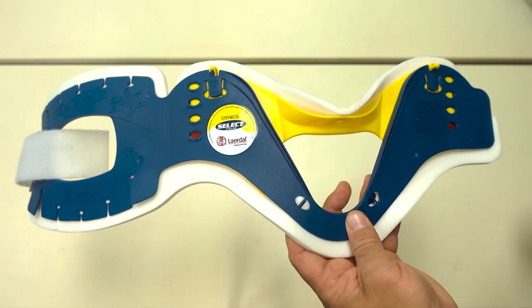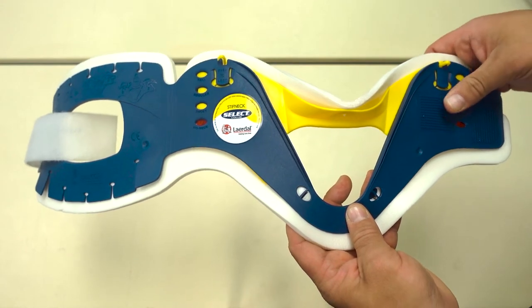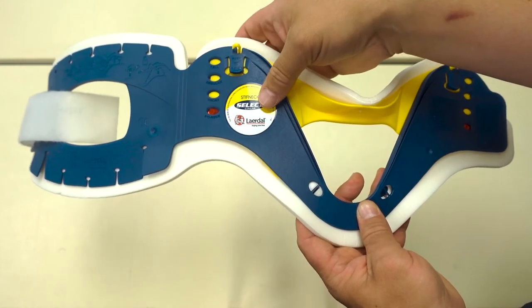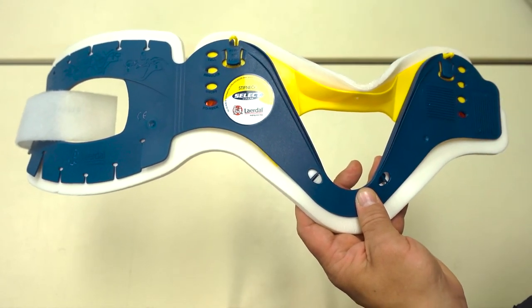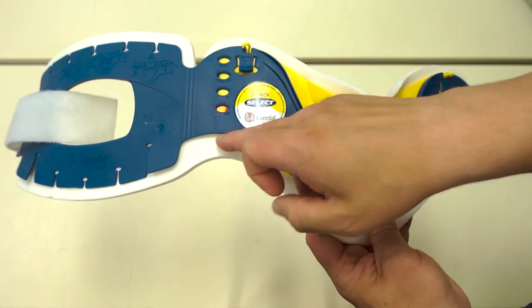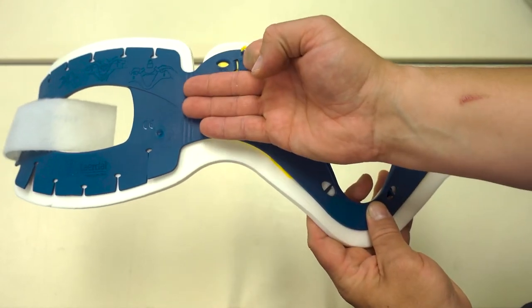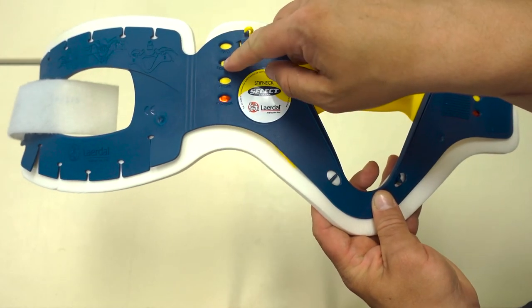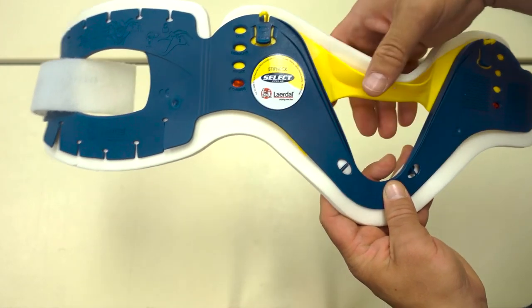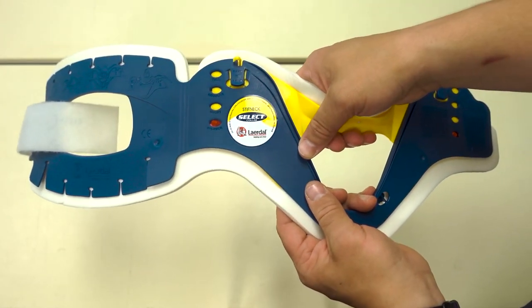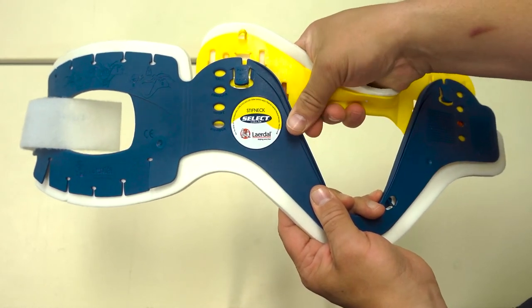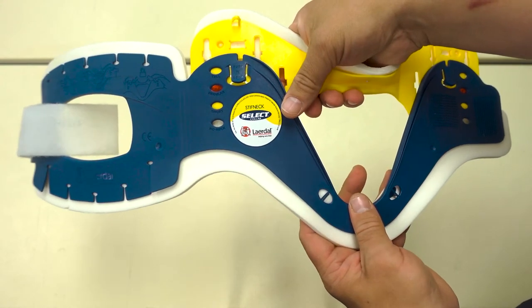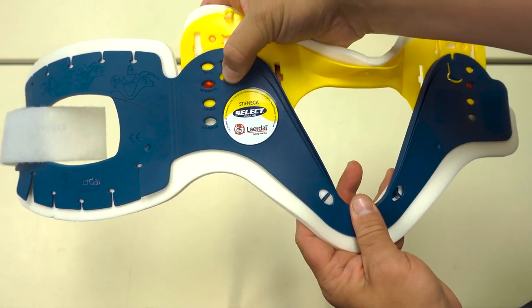To adjust the Laerdal Stiff Neck, if necessary, begin by releasing the locks by pressing on the tabs from behind. Next, using the measure you took from the patient with your fingers, measure from the bottom of the plastic edge to the closest circle. For this one, it will be the third or regular size. Proceed to pull the chin piece up until the red is inside the selected circle. Lastly, press the tabs in to lock.